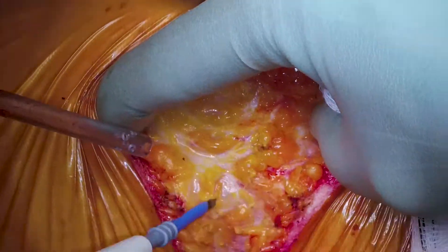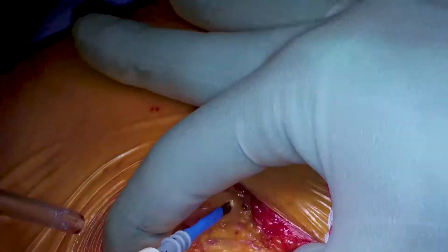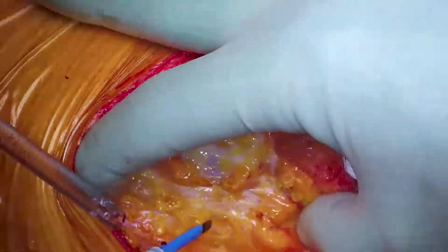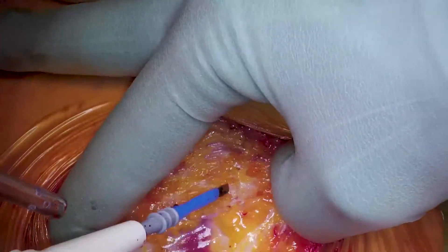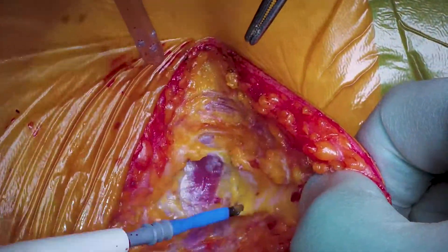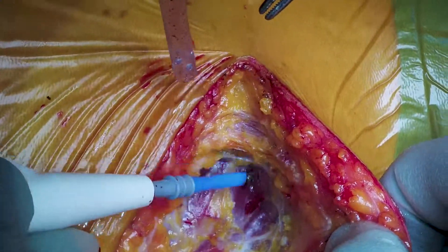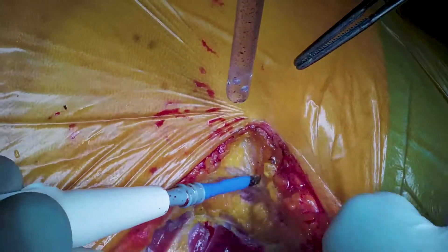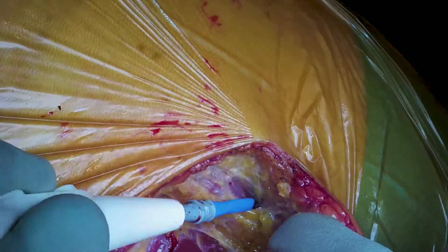The whole point of this technique is to cut through all the tissues to the muscles but not to actually dissect the muscles. We're cutting through some fatty tissue here, and below this there are two large groups of muscles: serratus anterior and latissimus dorsi. The aim is to retract the skin and elevate it, creating two flaps — one superficial and one deep to the latissimus muscles — which will allow us to retract through the muscles later in the operation to save cutting them.